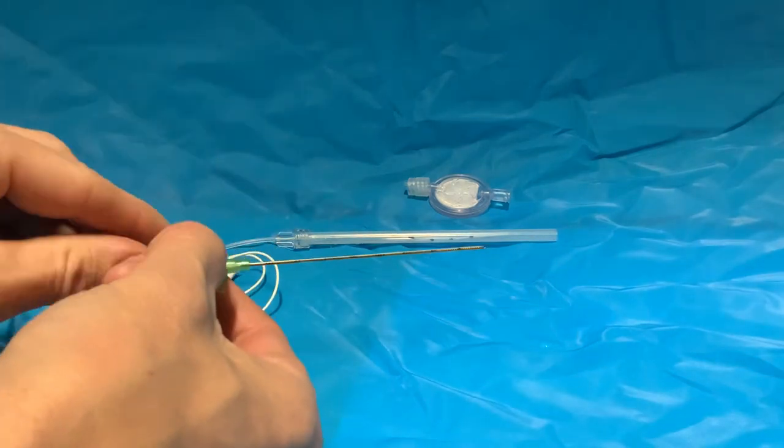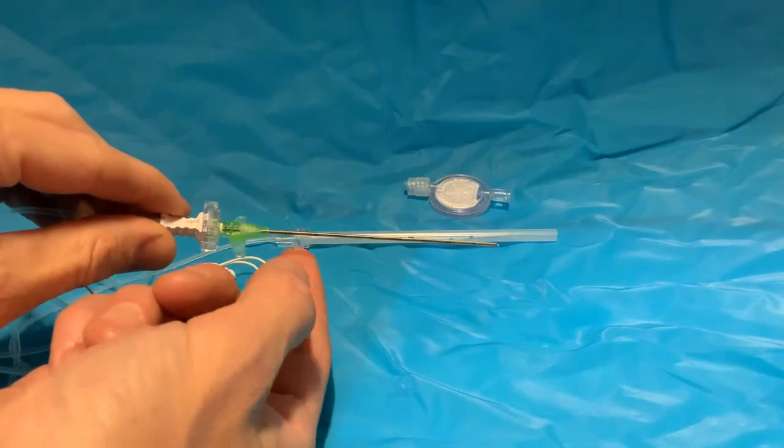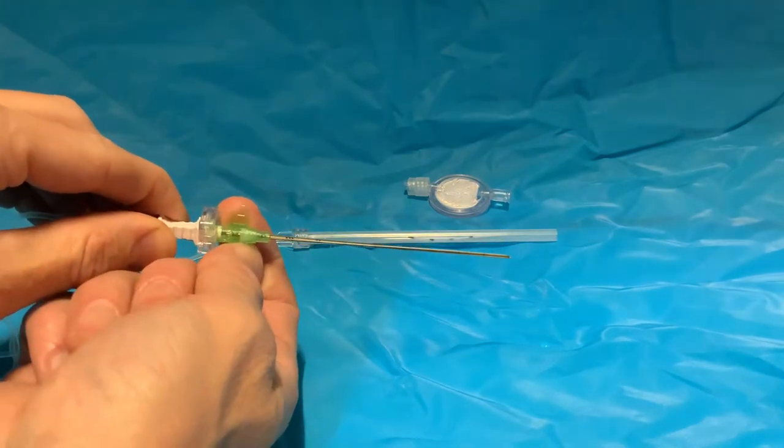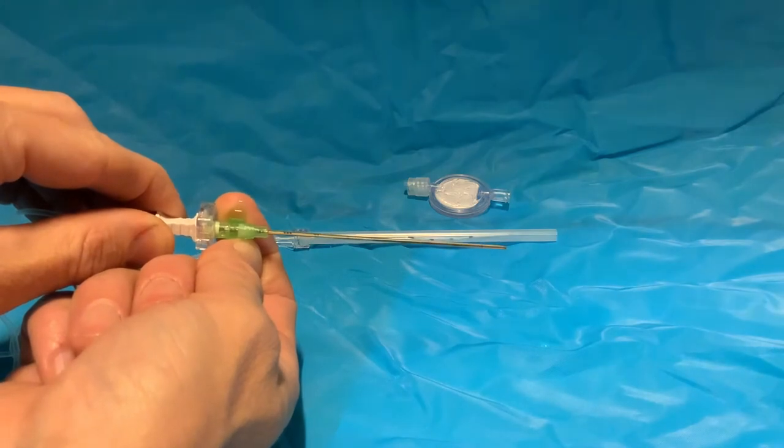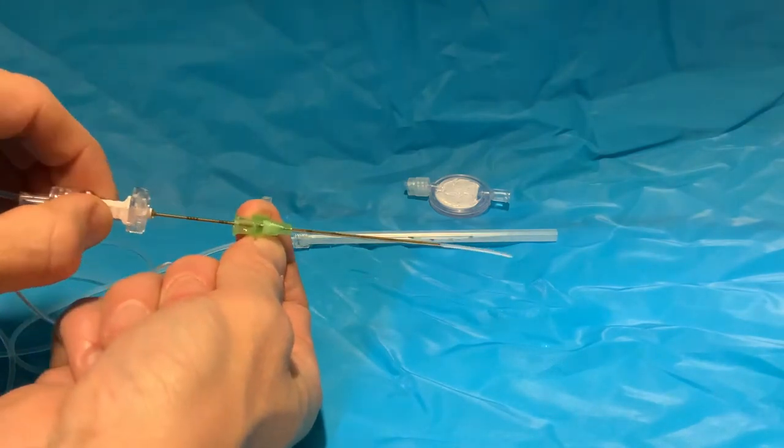Place the needle to the depth that you want it under ultrasound. When you're ready to remove it, you need to turn the hub of the cannula, not the needle, to 90 degrees and it will slide off.